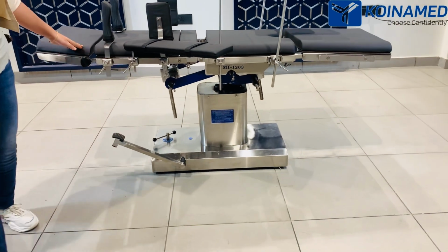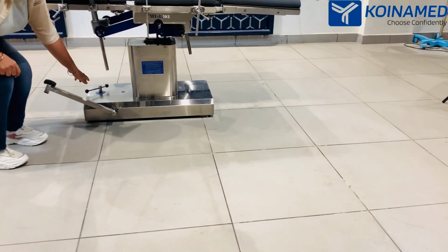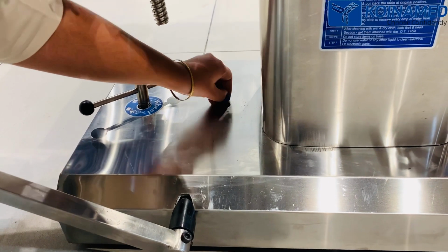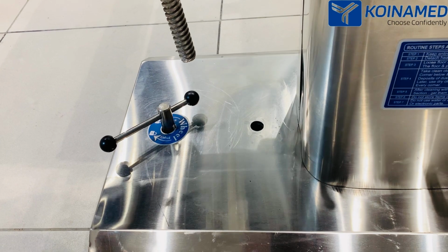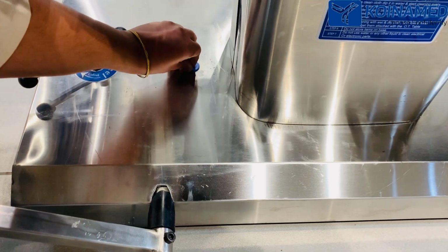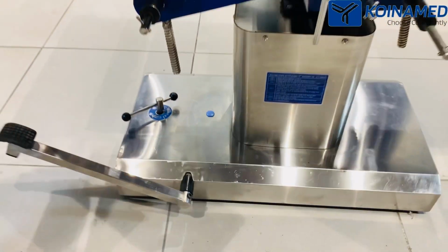If you see one thing more on the base of the table, we have provided this blue seal over here. When you open this seal, you have to put oil in it. As the hydraulic table works on oil, you put the oil here and put the seal back over here, just like this. This is all.